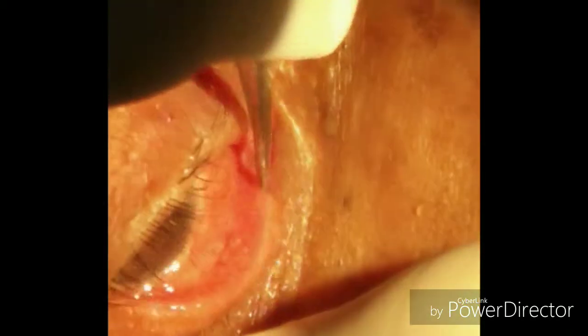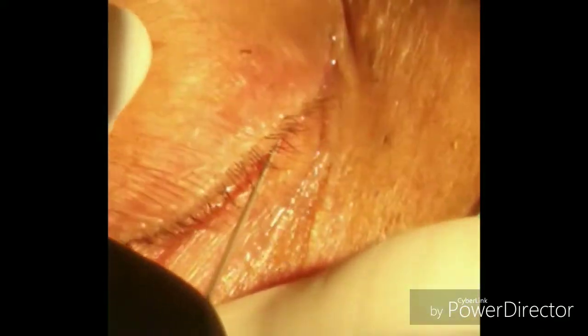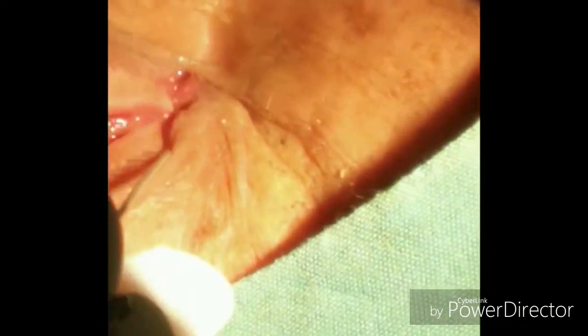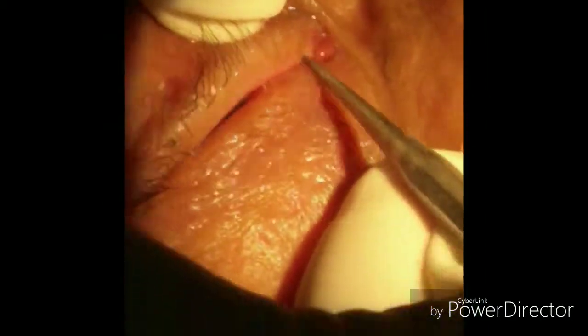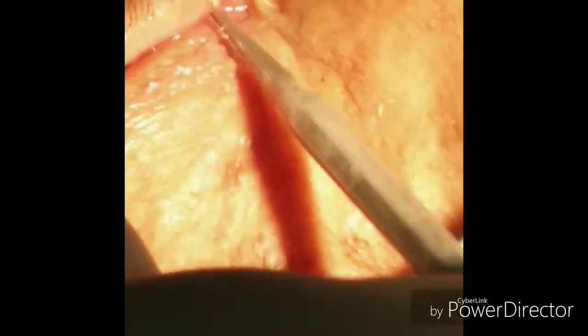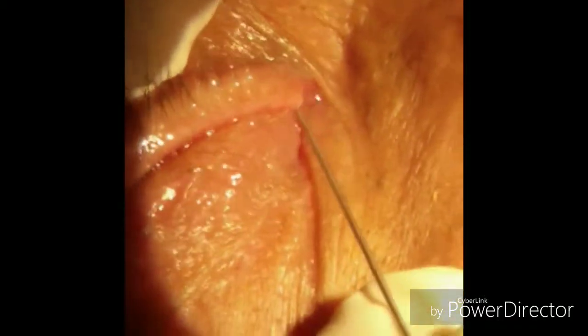After dilation, we will put the lacrimal probe first vertically and then horizontally, and we will push the probe as far as possible. If we feel a hard bony stop, it means there is nasolacrimal duct obstruction. If there is a soft, spongy feeling, then it means that canalicular obstruction is present. Now we perform superior punctum dilation followed by probing.